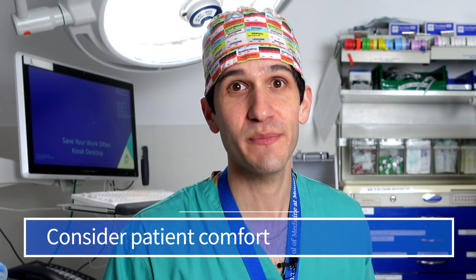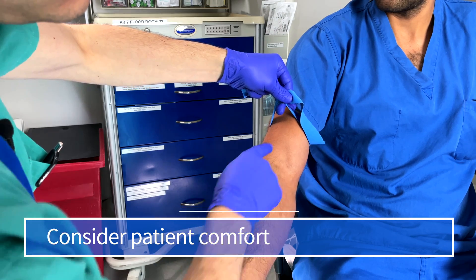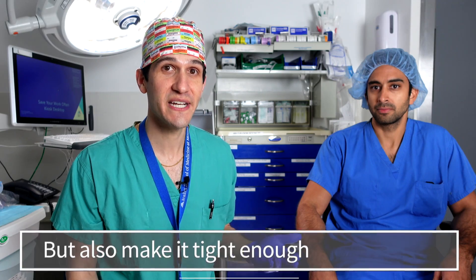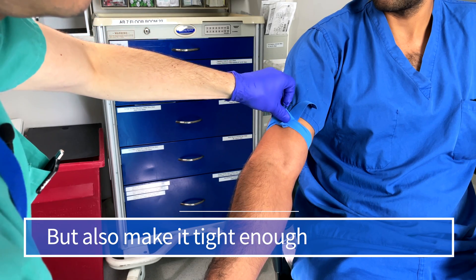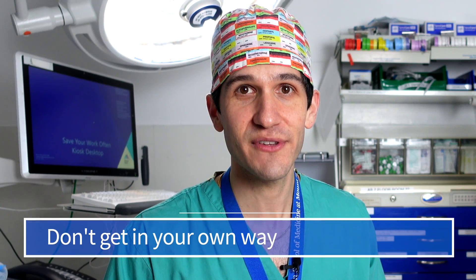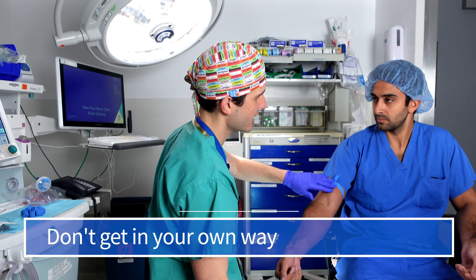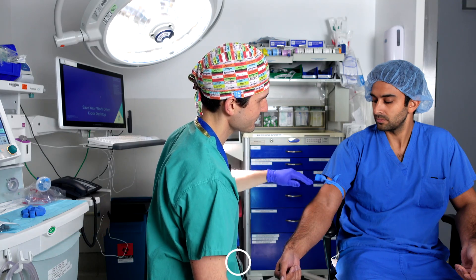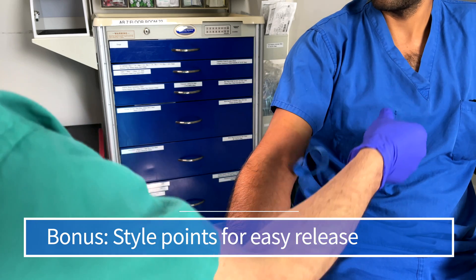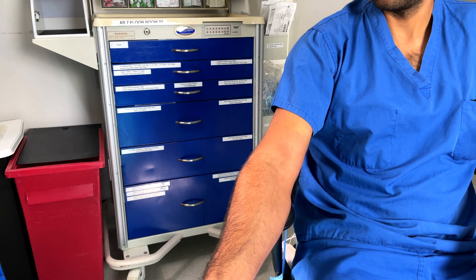Placing a tourniquet is actually a lot more nuanced than one might think. For one, you have to consider patient comfort — it's going to be tight, but you also want to make sure that if the patient has any body hair, you don't get that entrapped in the tourniquet. You also need to make sure it's tight enough that you cause significant venous pooling in the patient's extremity so that you can actually get blood return in your catheter. You also want to make sure that the tourniquet itself does not get in the way of the equipment you're using, particularly the needle as it goes into the patient's skin. And you want to make sure that it's easy to release the tourniquet so that you can have a free hand available to manipulate other equipment as you're finishing up your IV placement or blood draw.